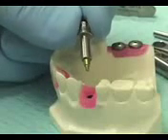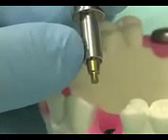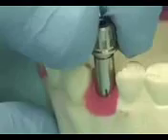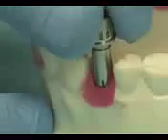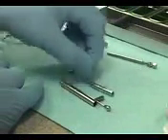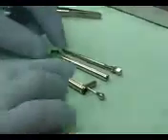So we place our solid abutment in the driver, again lining the black line on the driver up with the groove on the solid abutment. That's placed in our patient, lined up carefully, and we just tighten that down, finger tight as we can get it. Now I'm going to set our patient aside just for a moment and take the pieces of our torque driver out of our prosthetic kit.